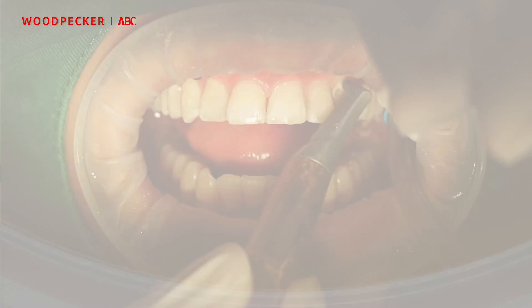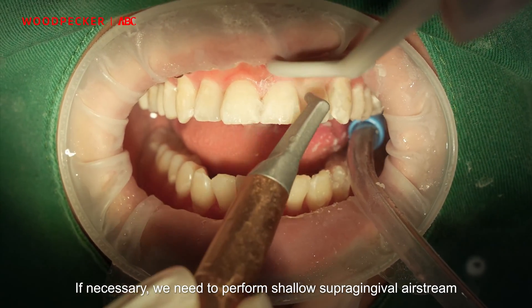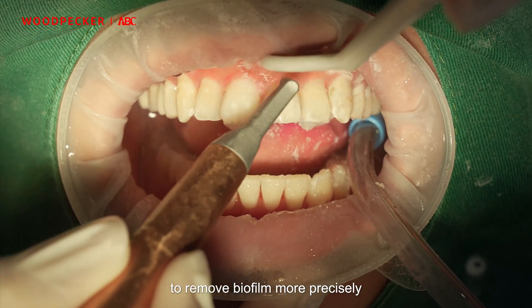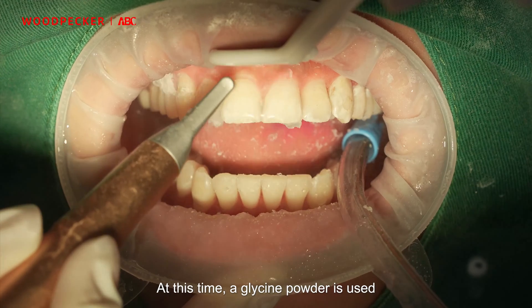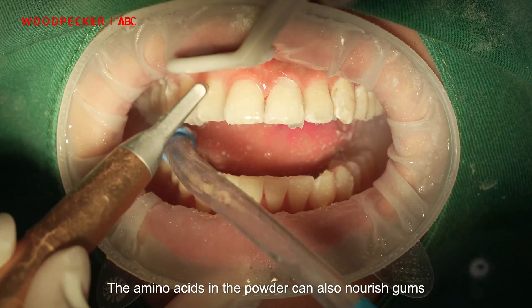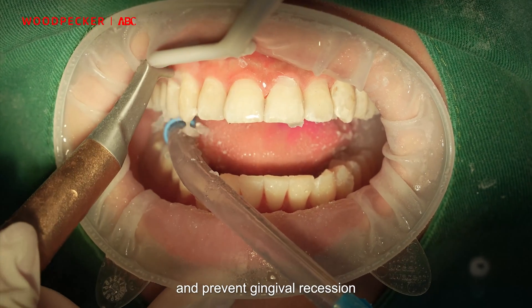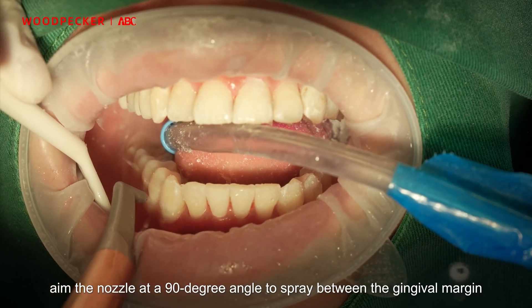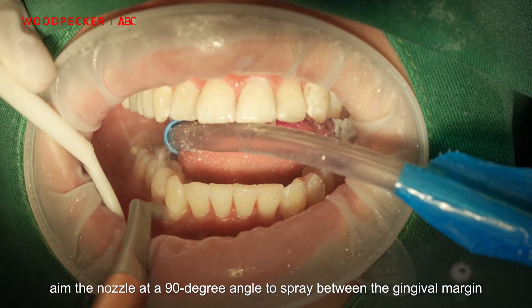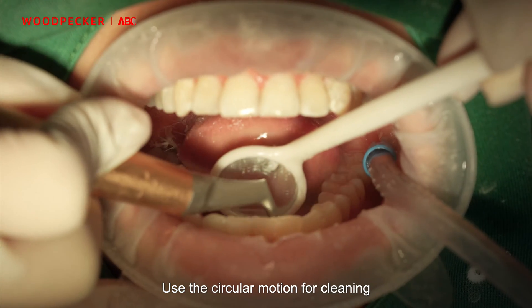Step 6: Subgingival Airstream. If necessary, we need to perform shallow subgingival airstreams to remove biofilms more precisely. At this time, a glycine powder is used. The amino acids in the powder can also nourish the gums and prevent gingival recession. During operation, aim the nozzle at a 90-degree angle to spray between the gingival margin and the teeth. Use a circular motion for cleaning.